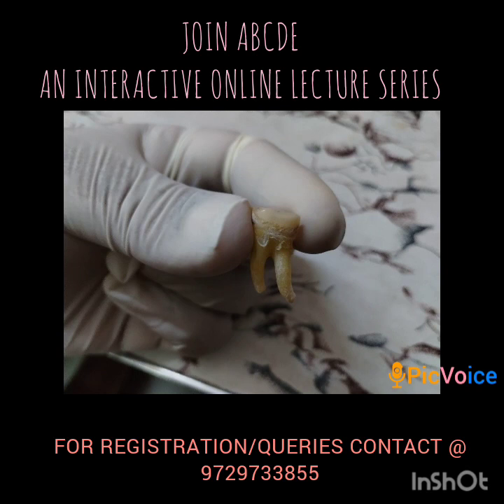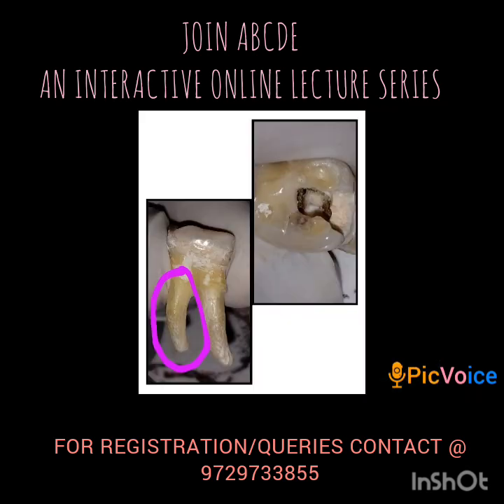So for demonstration purposes, I've selected a mandibular molar. As you can see, it has a shorter root and a longer root. So I prepared the access cavity and I found four canals, and two of them are readily visible because PMP has been done in them, and these two correspond to the orifices of the shorter root.